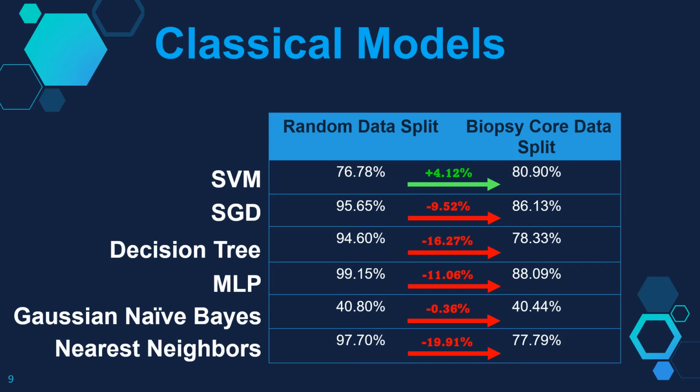And then with the MLP, it performed the best with the highest accuracy in both the pre-data split and post-data split subsets. And then looking at nearest neighbors, suffering a 20% accuracy decrease because it references those examples from training to compare against testing data it sees, and because the data split cut out that adjacent pixels being tested, it suffered greatly from this.